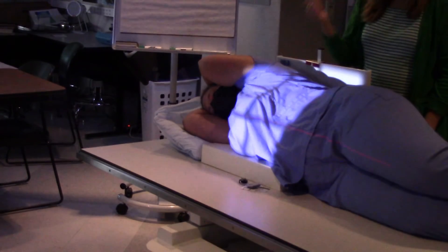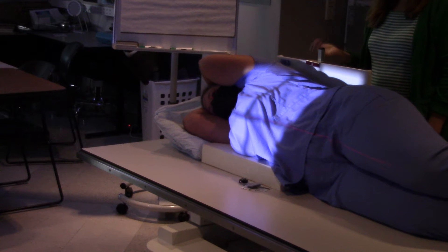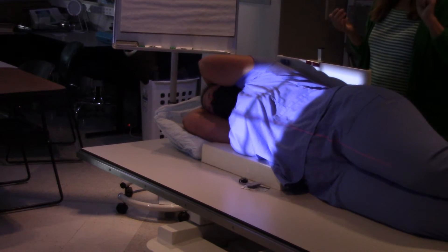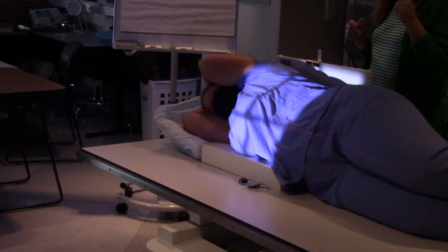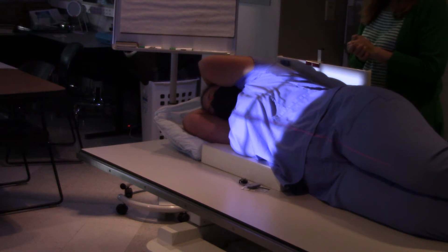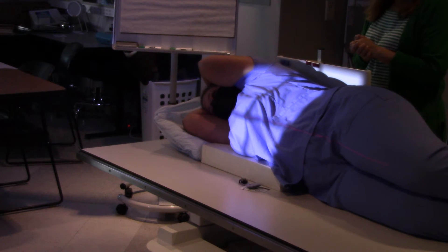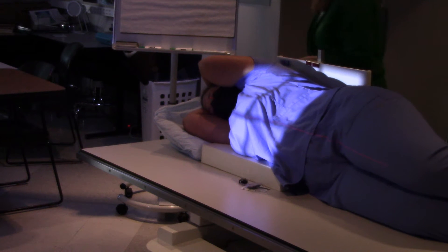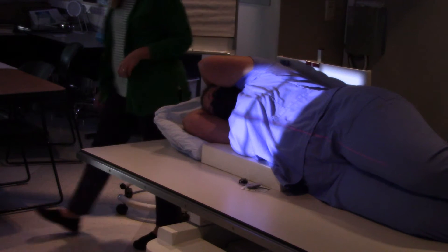Think about where the right side fluid is — is it down on the table, or is it up under the mediastinum? The fluid is down. How about her left fluid? The left side of the mediastinum. The right fluid is right there. Did that make sense with the cleaning supplies demonstration? Suspected fluid goes down, suspected air goes up.